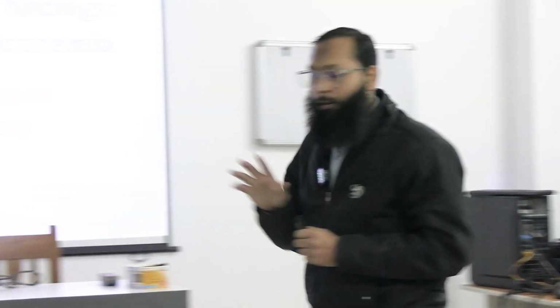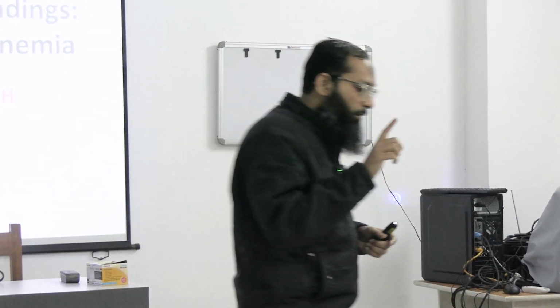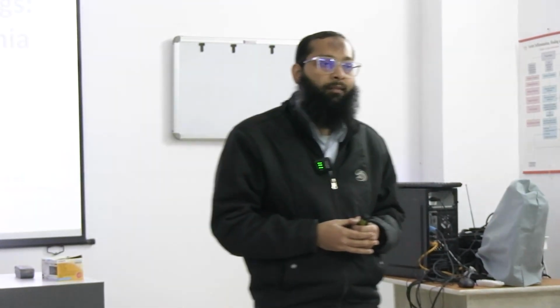So, who was saying about the staining? Now tell me, first of all, you dropped the stain solution on the slide and covered the slide. What are you going to do now? Wait for 2 minutes. Very good. Then you will put the distilled water.